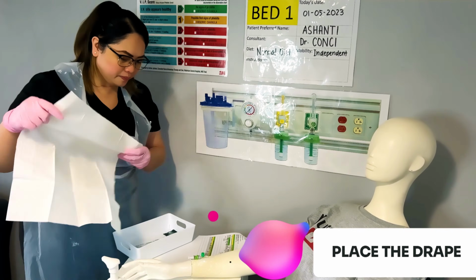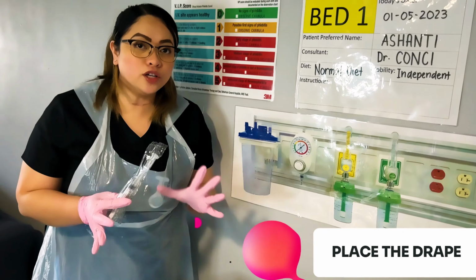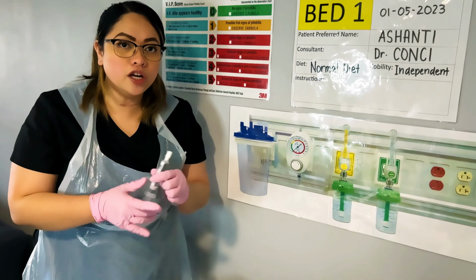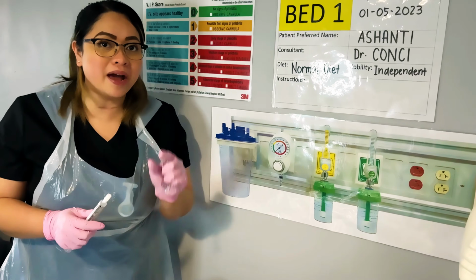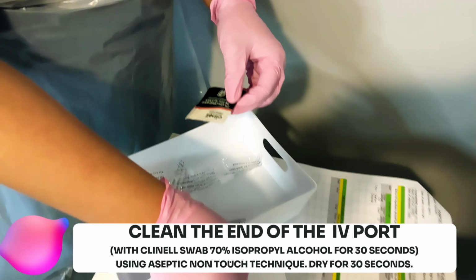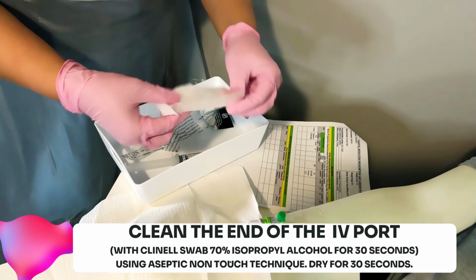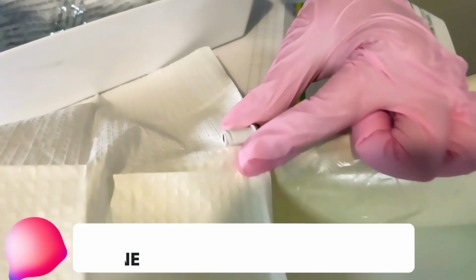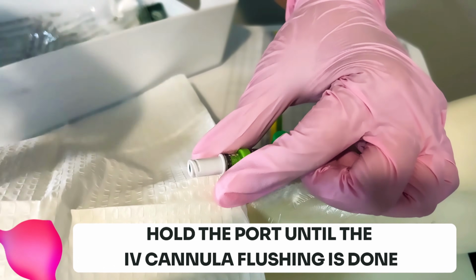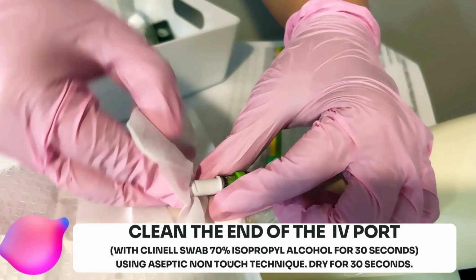I'm going to get the drape. So nurses, here's the tip. I'm going to prepare first the syringe because later on, once I've touched that port, I can't remove my hand in there. Okay? Now, I'm going to clean the port right here. Open your swab. Now, once you hold this port, you can't remove your hand anymore. So, within 30 seconds, you have to clean the port.